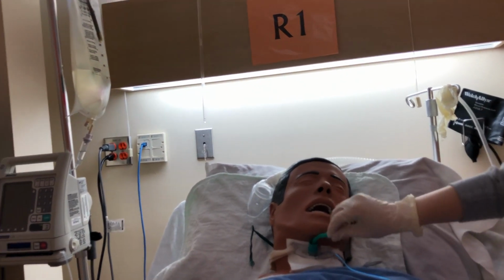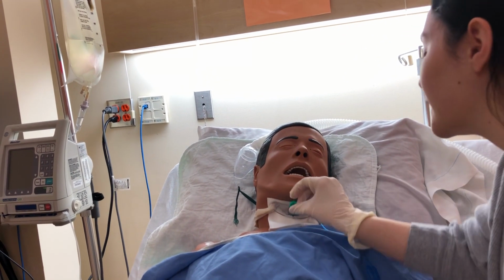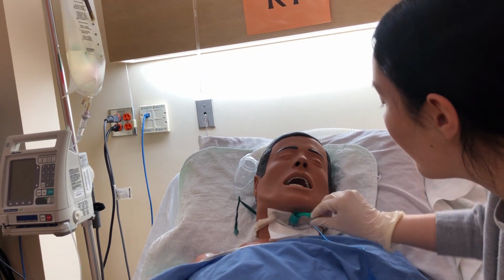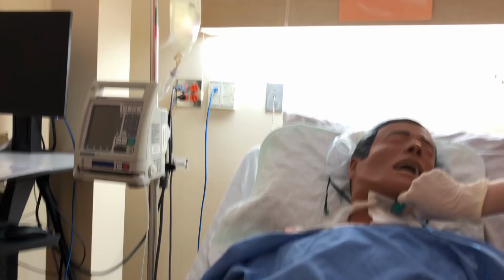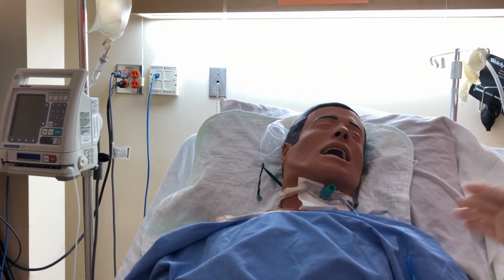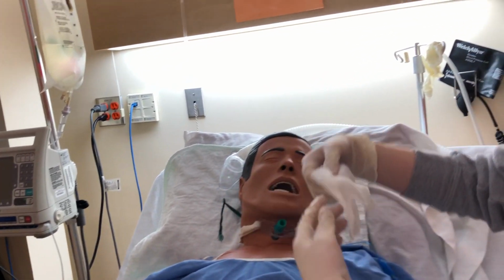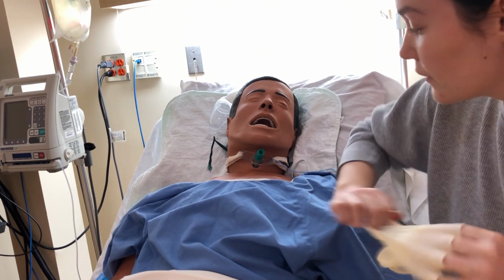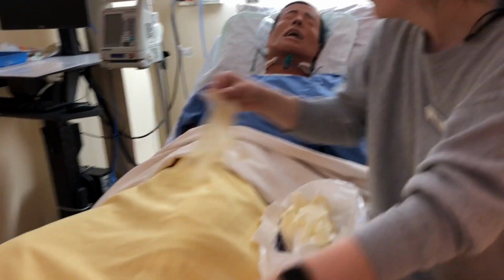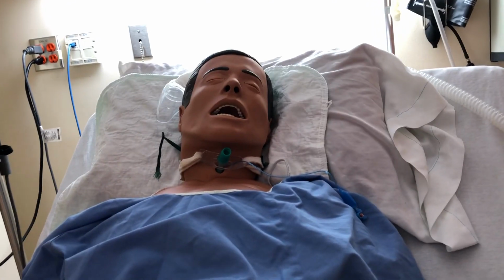Now with Jake, he's a little bit more stiff, so it's actually a little harder to put this inner cannula in on him. But I'm still making sure that I'm only touching the top. Now I'm going to dispose of this, assess the stoma site. I'm going to take off my gloves, perform hand hygiene, put on new clean gloves. The stoma looks good. And now I can get to cleaning.